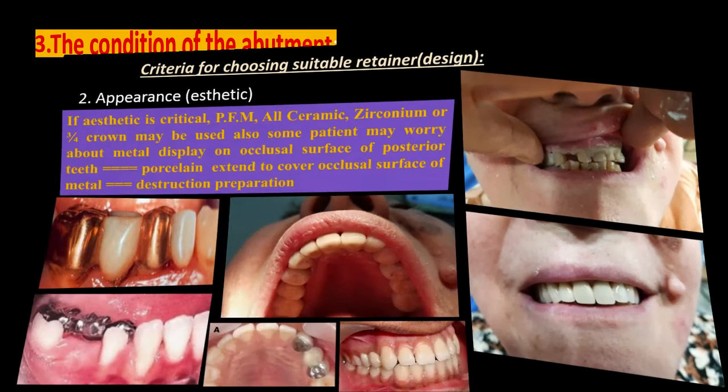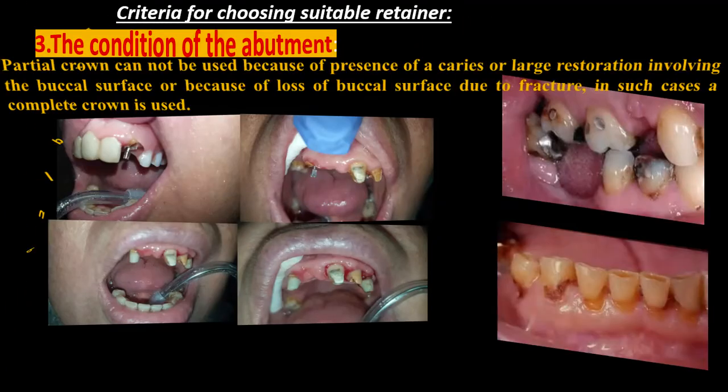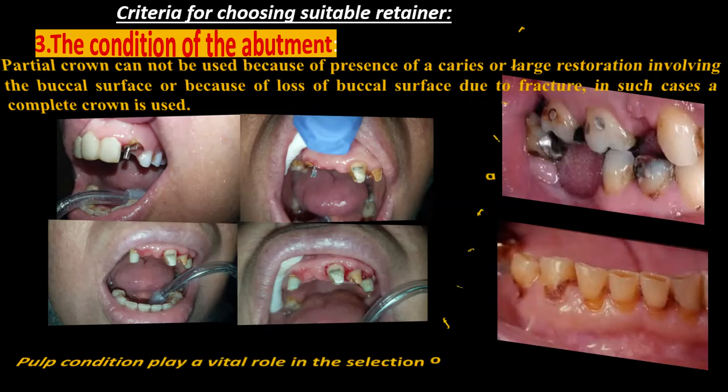The other factor اللي involved in the selection of a suitable retainer condition of the tooth. طبعا مريض ممكن يجيك tooth بكاريز، الكاريز ممكن extensive، أو ممكن الكاريز يكون the area of the finishing line. طبعا لما يكون التوث healthy and bulky يعطيك مجال لأي نوع من الكراون preparation، ممكن يسوي full أو partial. لكن لما يكون كاريز راح يحددنا كاريز.